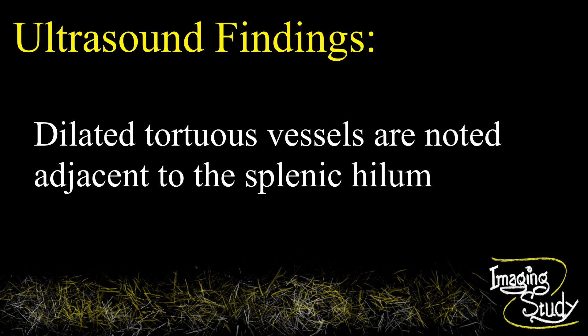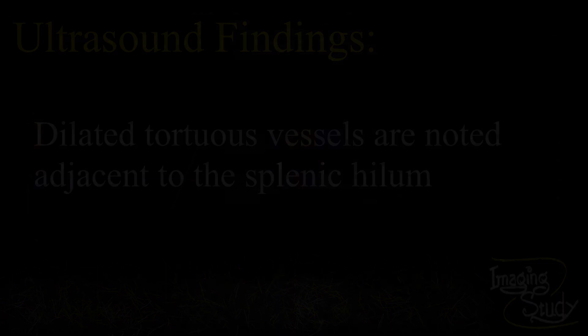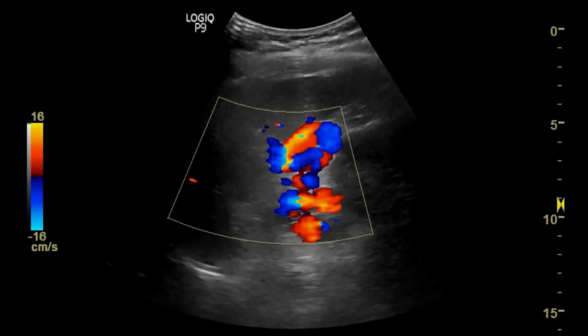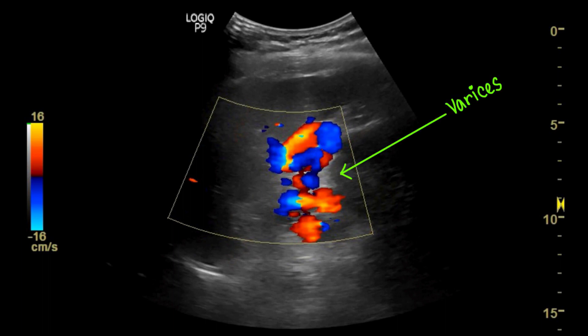Multiple anechoic dilated tortuous vessels are noted at the splenic hilar region. The spleen is mildly enlarged.